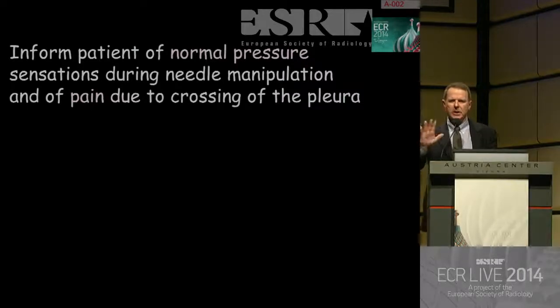Inform the patient that the local anesthesia will kill the pain, but not the sensation. Okay? So he will feel the needle going into the body. So this is a tactile sensation. It's not pain. Of course, when you reach the pleura, it will be pain. Okay? At that point there will be pain for 1 second, because the pleura hurts when you traverse it, not after you have traversed it. Okay? So this is very clear. You're going to feel a sharp sensation, but don't worry, it will go away in a second. Okay? Because otherwise they move.